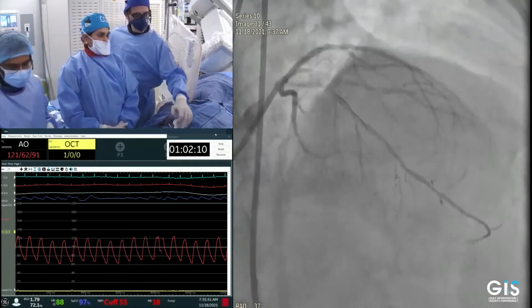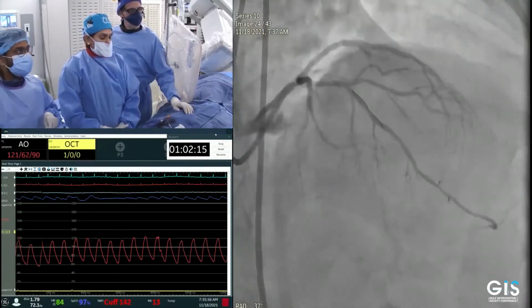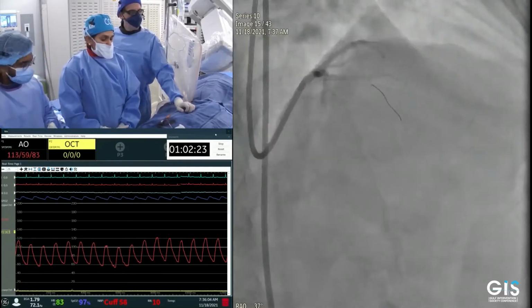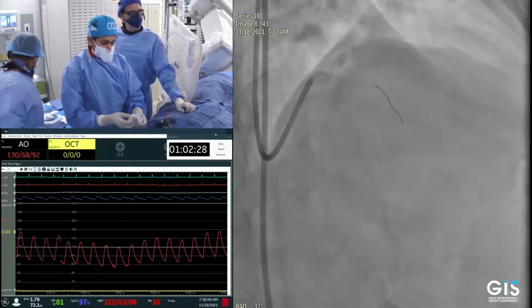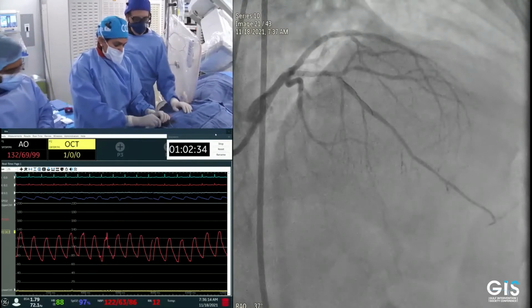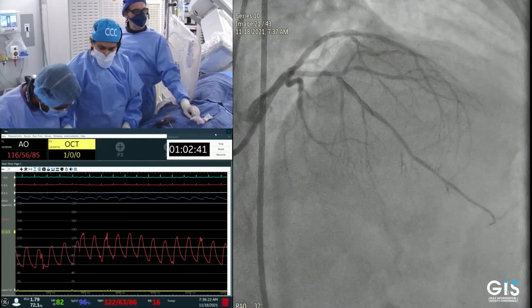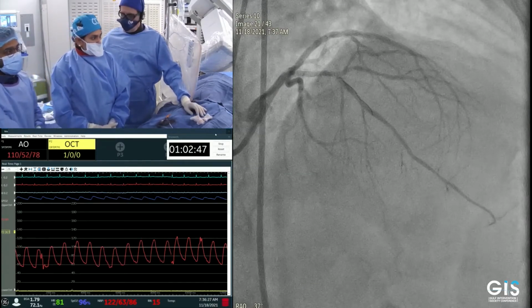So, Dr. Kenny, you changed the rota wire. Do you suggest to use a microcatheter here in case we go into the wrong lumen, for the fellows here? I know you're an expert, but what about fellows? Initially it is better to exchange, and definitely needed to exchange over a microcatheter if there is some angulation or some other thing proximally. But over here you see it is rather straight, no real question for a dissection here. One of the safest recrossings, no? Yeah.